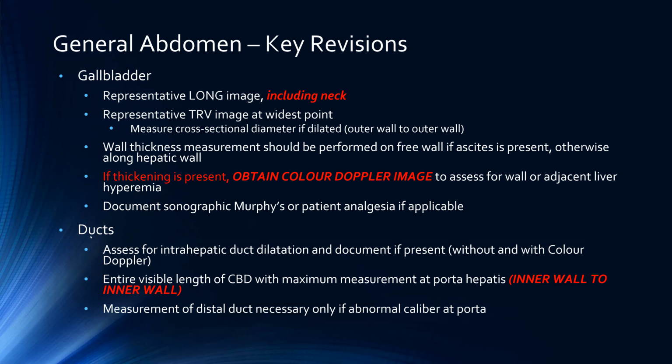And then with regards to duct assessment, for the most part, try to image as much of the CBD in long axis as possible, but the maximum measurement should be obtained in the porta hepatis. And just to highlight, it's always an inner wall to inner wall measurement of that CBD. Measuring the distal duct really is only necessary if the caliber of the CBD is abnormal in the porta. If it's a normal caliber CBD, there's no necessity to go looking for dilatation more distal to that.